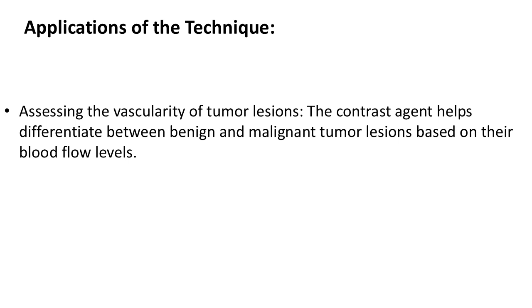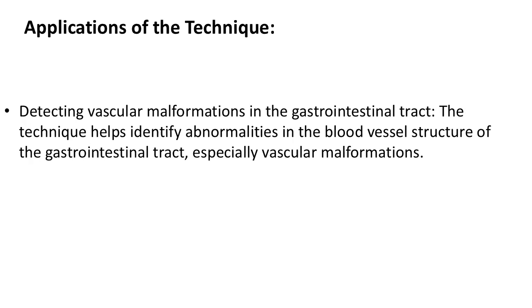The contrast agent helps differentiate between benign and malignant tumor lesions based on their blood flow levels. Applications of the technique: detecting vascular malformations in the gastrointestinal tract. The technique helps identify abnormalities in the blood vessel structure of the gastrointestinal tract, especially vascular malformations.